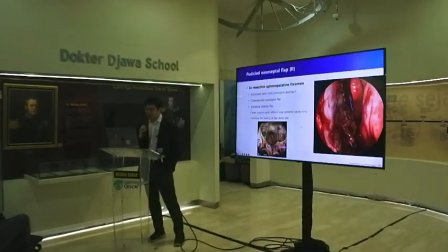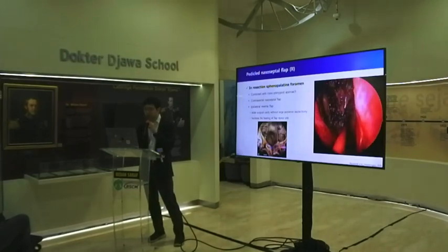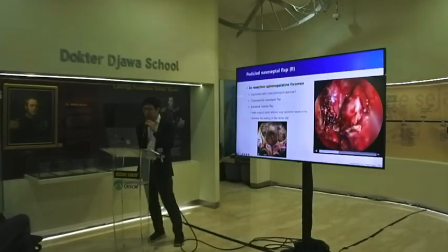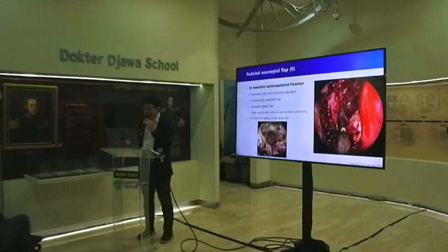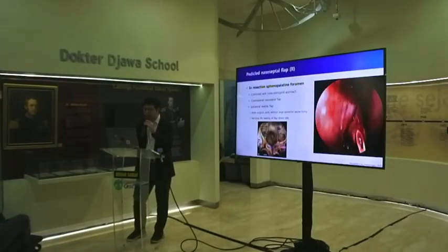During the dissection, we must be careful to avoid septal perforation. The goal is to create a superior margin below the insertion of the middle turbinate, and we can also consider a contralateral nasal septal flap or a unilateral reverse flap, which is useful for wide surgical cavities.